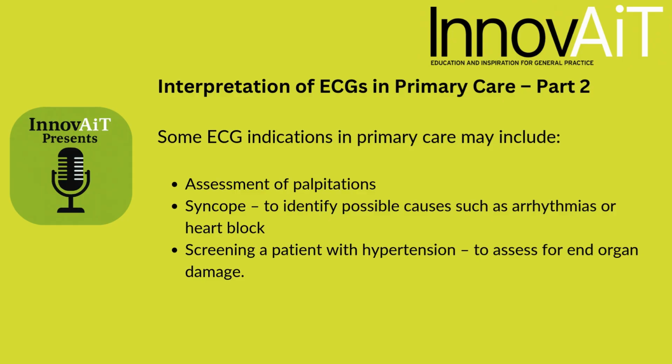It's important to mention some ECG indications in primary care, which might include assessment of palpitation, syncope, or could be part of screening of patient with hypertension.